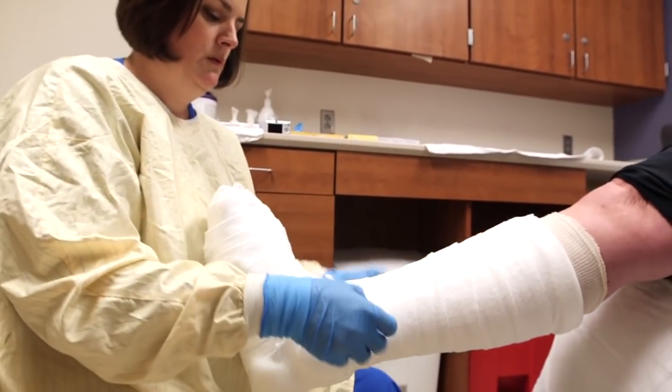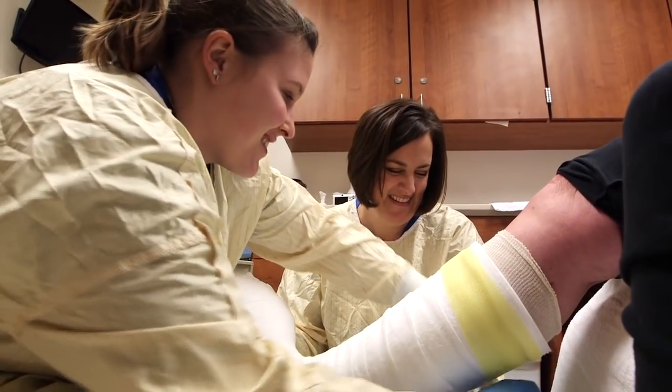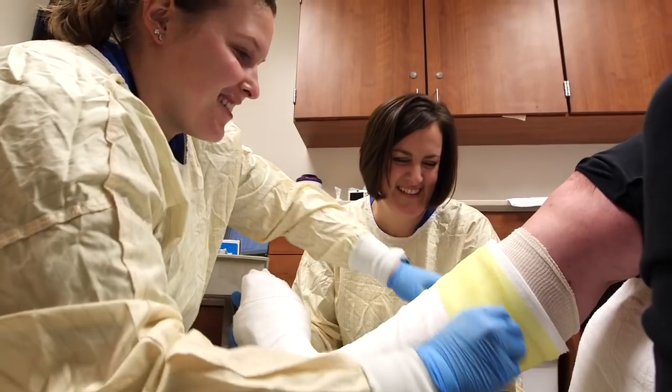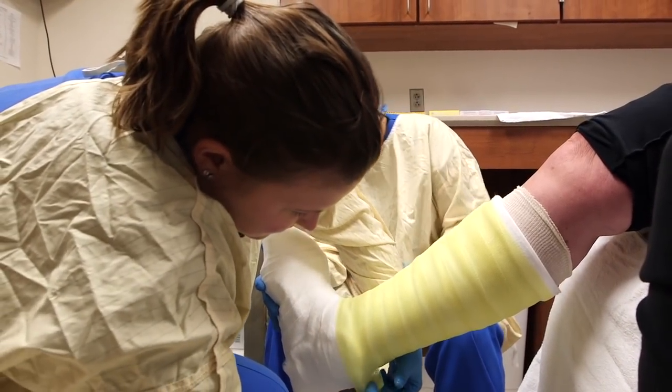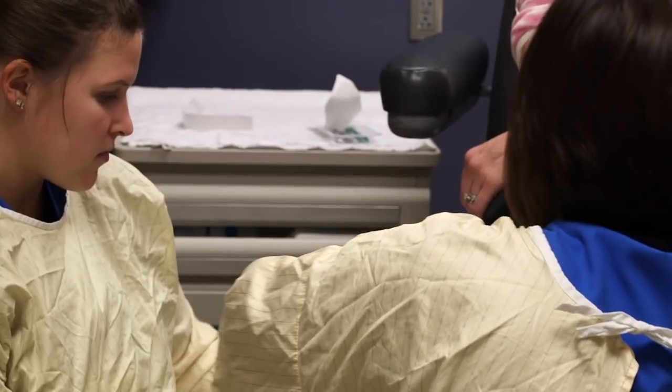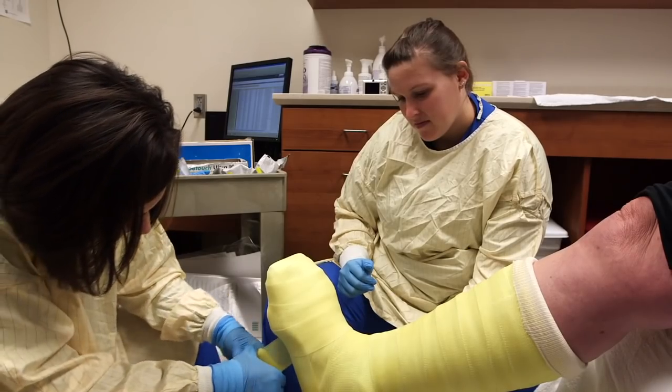When a patient comes to us for the first time, we put on a cast and we typically ask them to come back three or four days later to take that cast off and make sure that everything is okay. After that, because patients have an open wound, we have to be a little more careful, so we change those casts once a week.